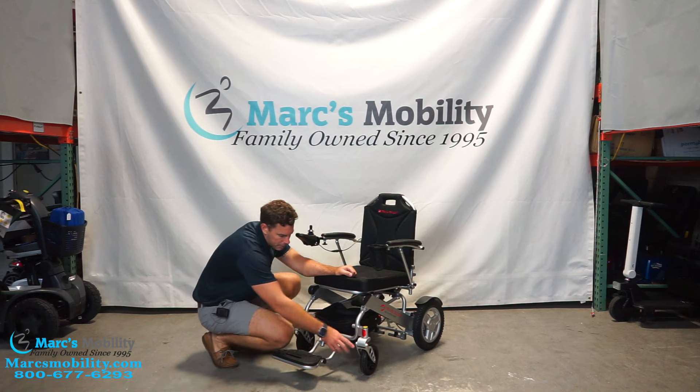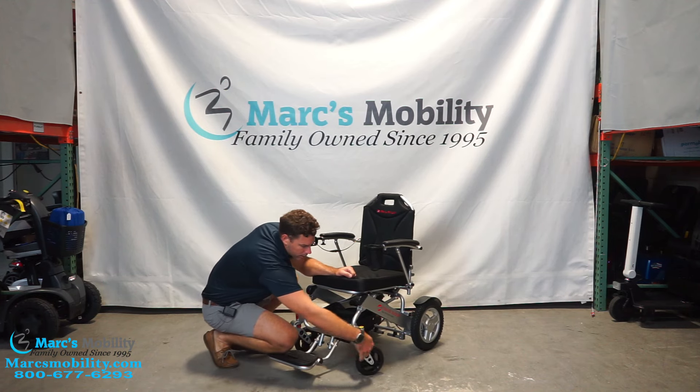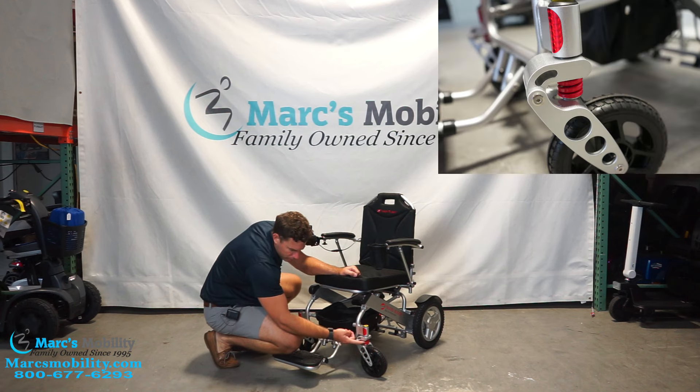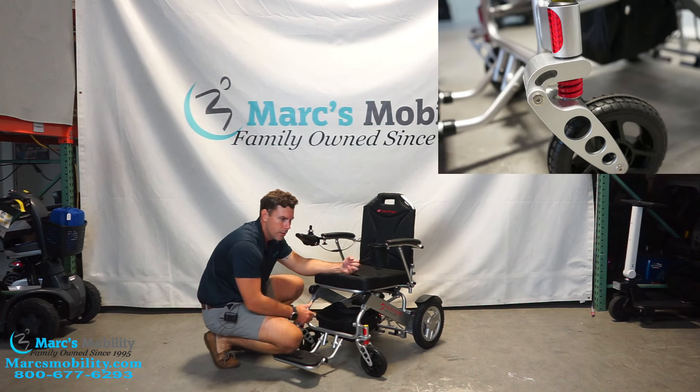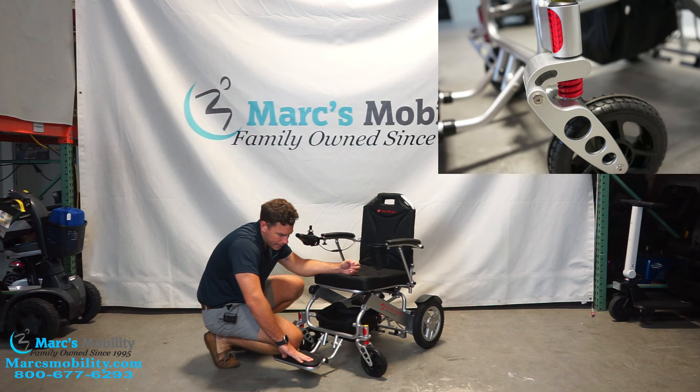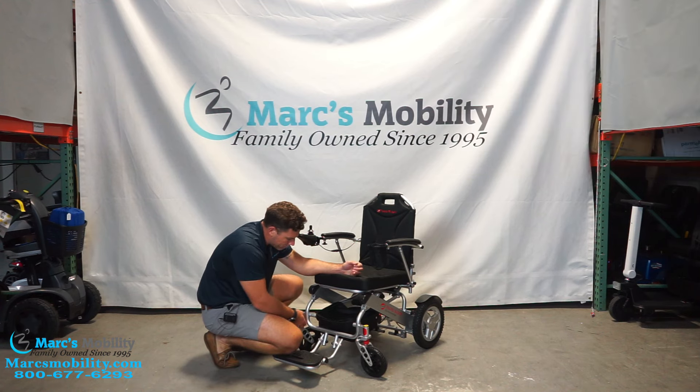They also changed the front caster design. It looks a little different and they added a shock absorber, so it will ride a little bit smoother than previous versions. It has this shock absorber on both front caster wheels, which is very nice to take out some of that vibration.